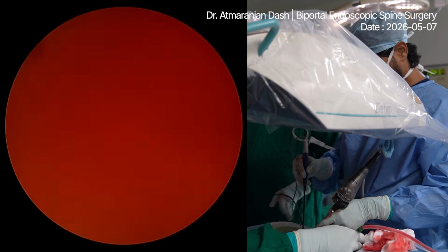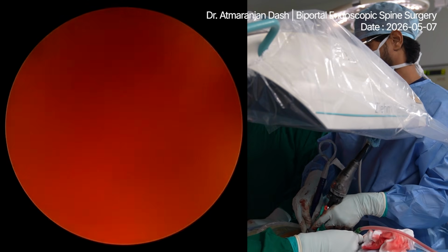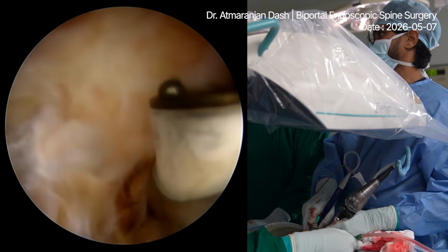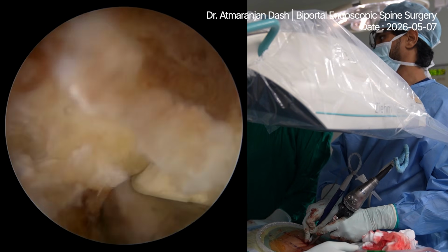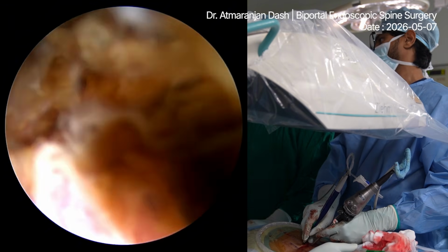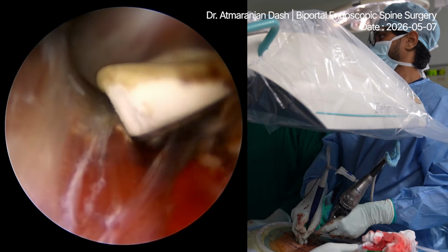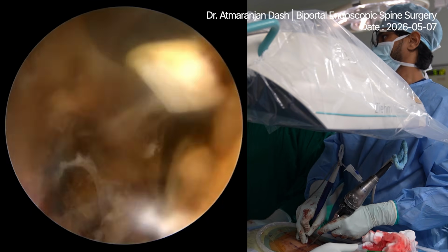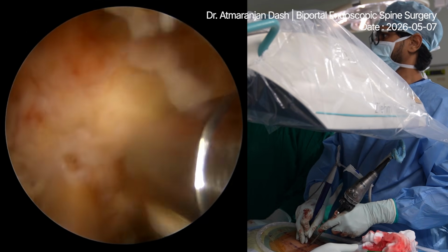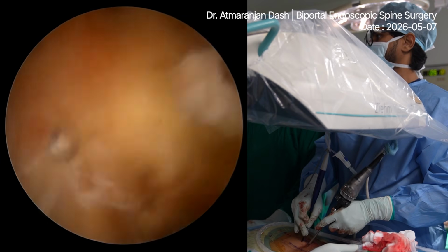Again it is oozing. First thing for control of oozing is to identify it. So oozing is only from here, coagulation.